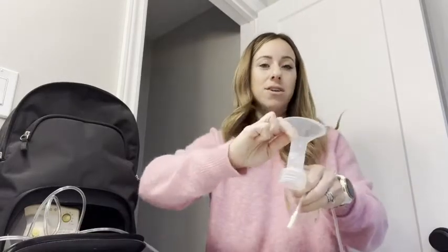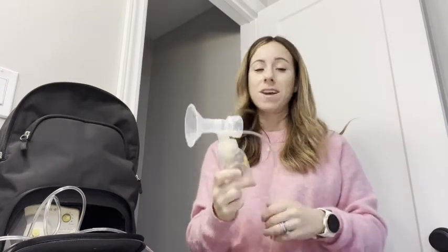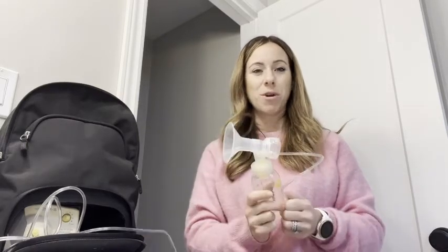Everything is dishwasher safe, but I don't personally put plastic in the dishwasher. It's easy to take apart and easy to put back together — as you can see, I'm ready to go pump if I need to. My pumping days are over, but if yours have started, I definitely recommend this. The Medela brand is incredible, but that's just my point of view.